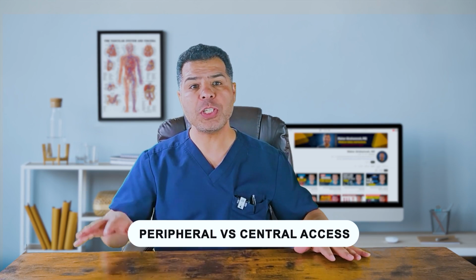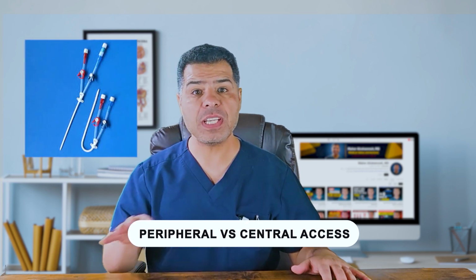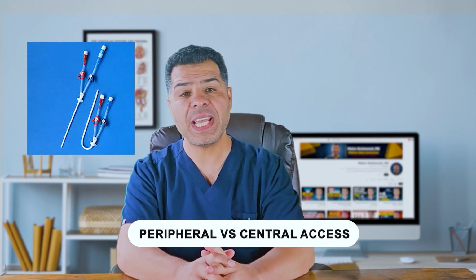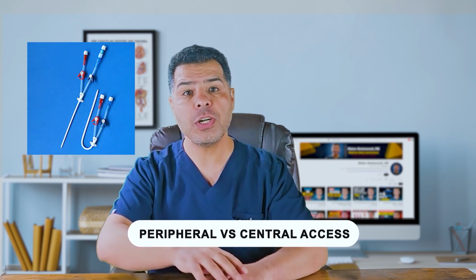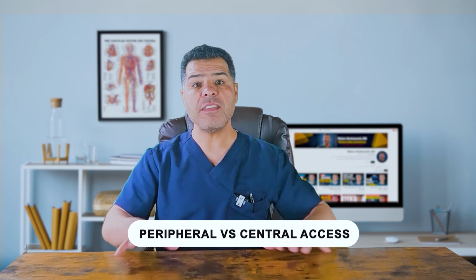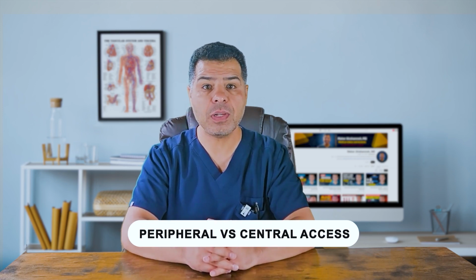Now, there are 2 special types of non-tunneled central lines that deserve mentioning here. First, temporary dialysis catheter. These are large bore central lines used when a patient needs urgent dialysis or CRRT, which is the continuous renal replacement therapy. They are usually placed in the right internal jugular or femoral vein if IJ access is not possible. If the need for dialysis becomes long-term, these should be transitioned to a tunneled dialysis catheter like a permacath.